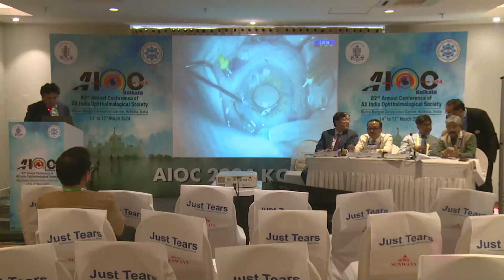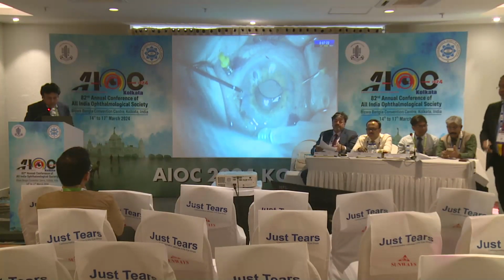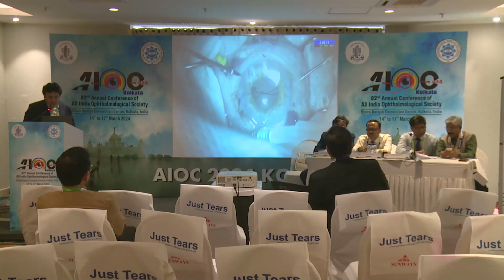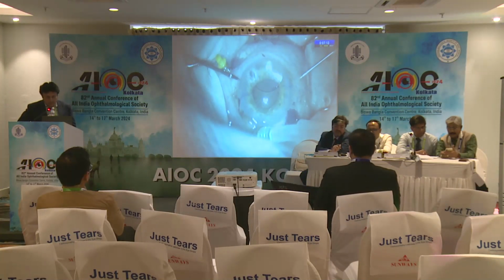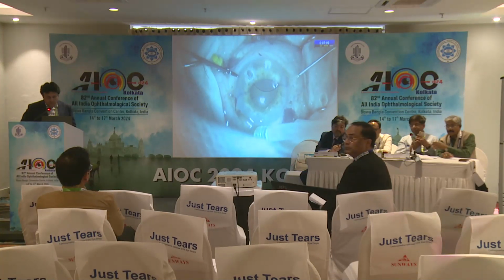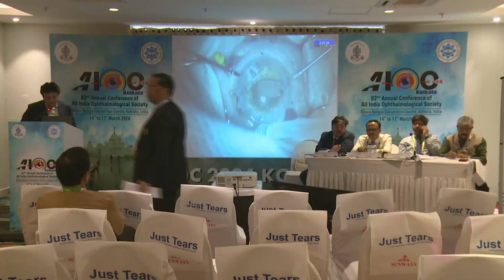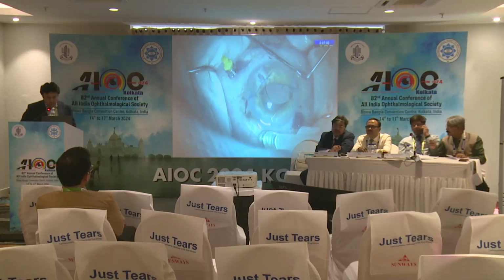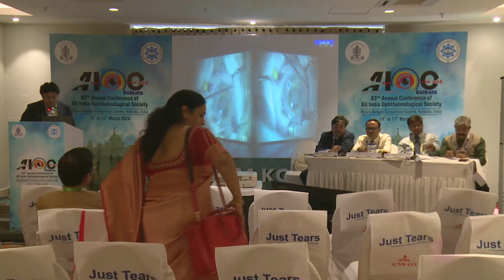This is a case of a posterior capsular rent and a subluxated 3-piece intraocular lens lying in the sulcus. The first step is to secure the lens by rotating it and bringing it into the anterior chamber. The next step is to insert a trocar into the pars plana and perform a limited anterior vitrectomy to clear the anterior chamber. Then 2 diametrically opposite points are marked and the 26-gauge needle is inserted into the pars plana.